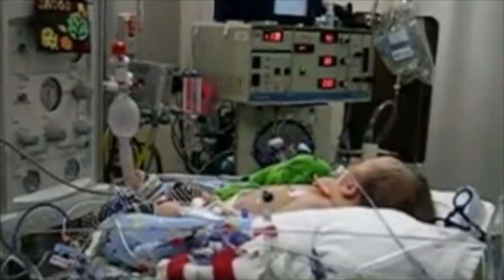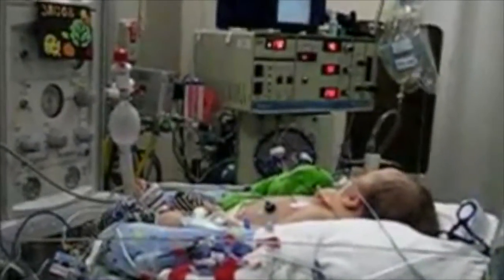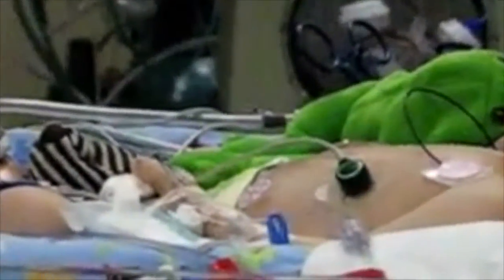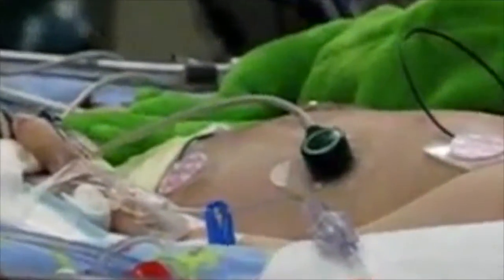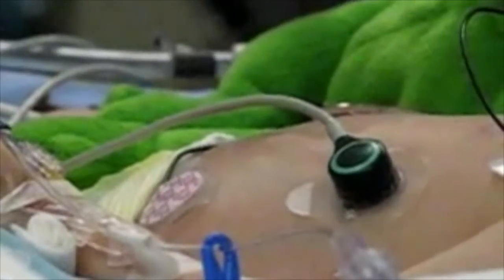This is a video of a baby on an actual oscillator. This video was taken of baby Jacob by his family, and he is 17 days old. And here's the sound an oscillator makes.